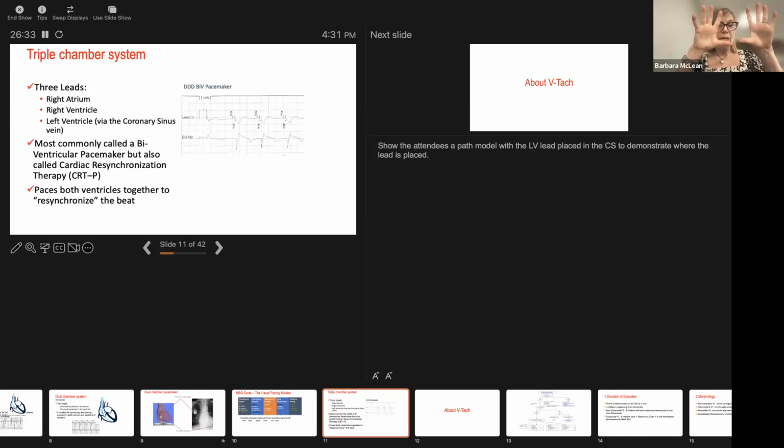So they are basically at the same time instead of what they're doing right now, which is right, then left, right, then left. You and I are almost at the same time. It's such a tiny difference. And that's what gives us the best possible blood flow forward and the best ejection fraction and the best cardiac function in order to survive.